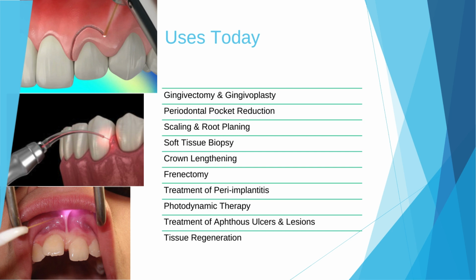Treatment of periimplantitis. Dental implants can be affected by periimplantitis, an inflammatory disease that can be treated with lasers. Without harming the implant surface, laser therapy can assist in removing biofilm and diseased tissue from the area surrounding the implant.